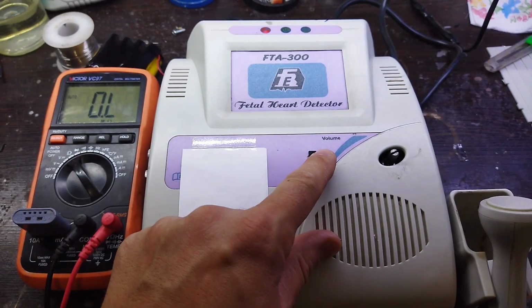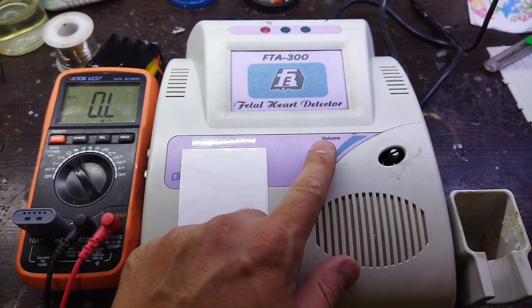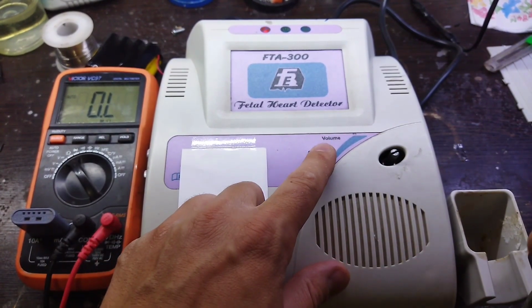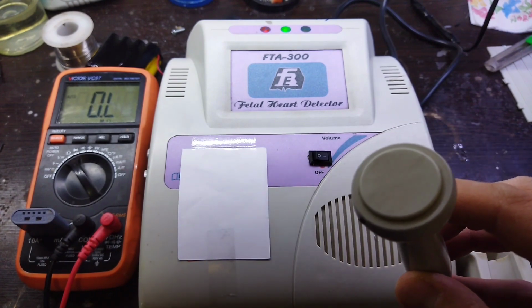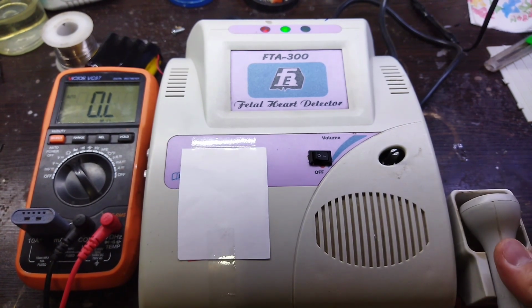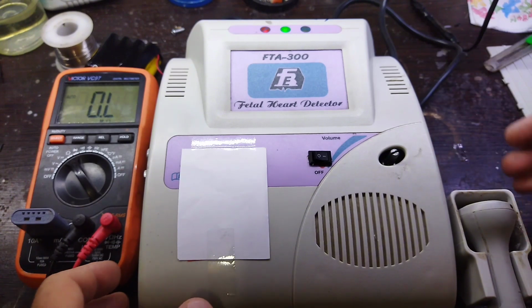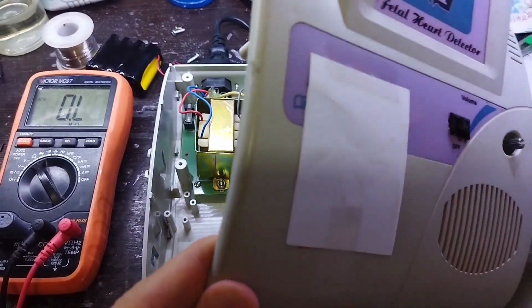I'm going to share with you how to repair the SONOKID device. Before repairing this device, I will give you some explanations about this device and how it works. The SONOKID device, which is also known as the embryo detector, is one of the tools for examining pregnant women. This device is considered one of the sub-branches of medical engineering. SONOKID is very useful in the field of gynecology and obstetrics. It is used to measure the heart rate of the fetus. Also, with SONOKID, the quality of the fetal heart sound can be checked.